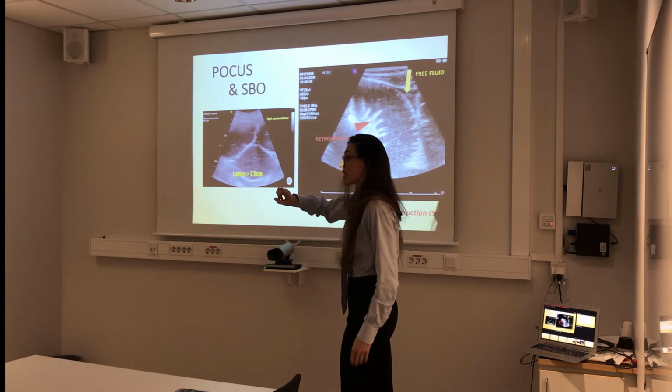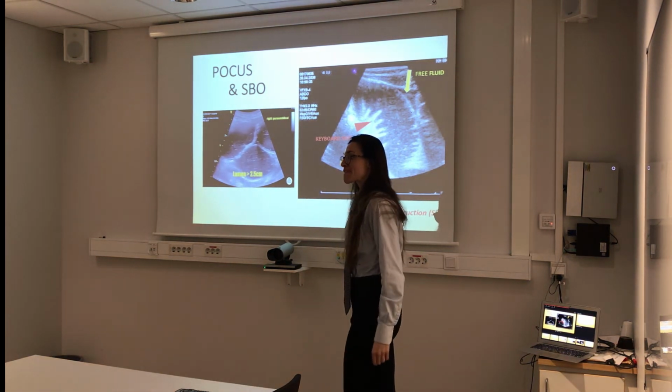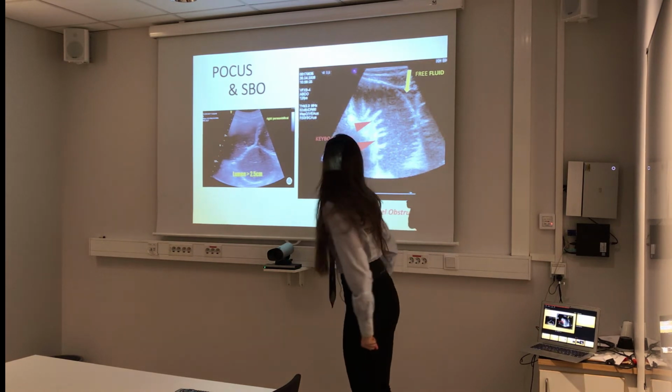But this is a good question. It depends on how you cut the loop. And I think also if you push with the probe, then maybe just push it like just. Yeah, just fan away the gas.